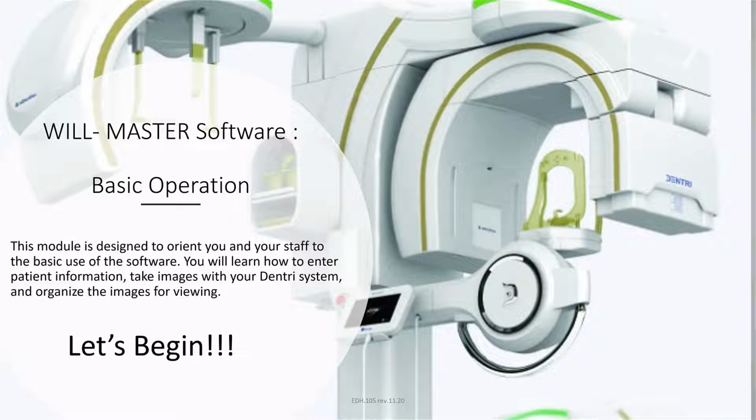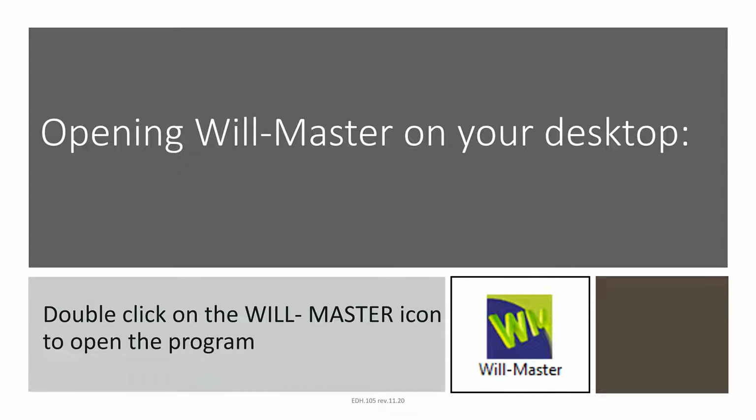This video will go over how to enter the patient's information, how to take a scan on the Dentri CBCT, and how to view the patient's images. The program you use to take or view a scan is WillMaster. To open WillMaster, you must click on the WillMaster icon.